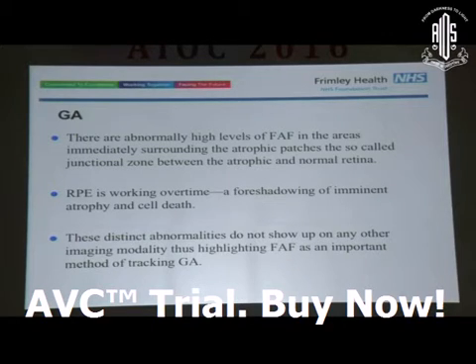What they say is that this is the area between your normal retina and the atrophic retina. The RPE here is working overtime, and this gives you an idea of the imminent atrophy that is going to take place in that area. And these distinct abnormalities do not show up in any of the other imaging modalities you can think of. It only shows up on FAF.